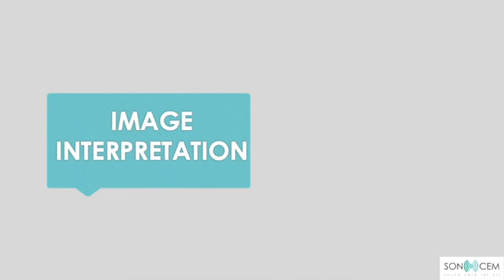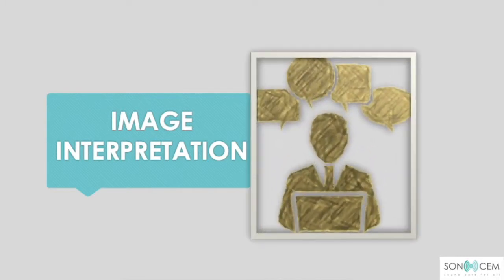After we know how to get a standard image, then we move to image interpretation. Remember, you have to get a standard image first before the interpretation. If not, you will interpret the image wrongly.